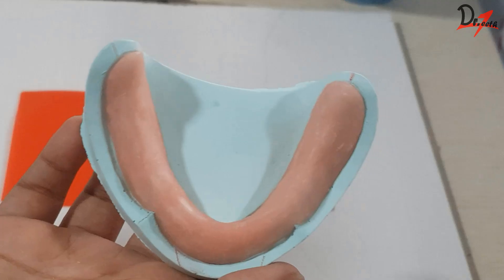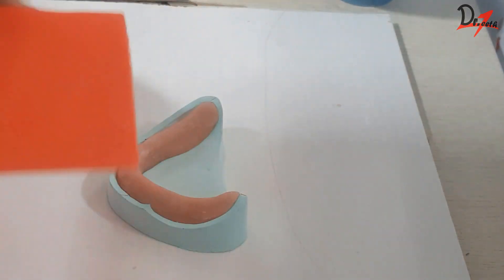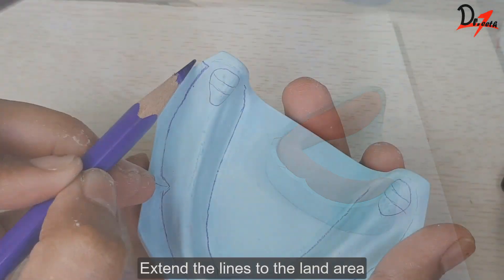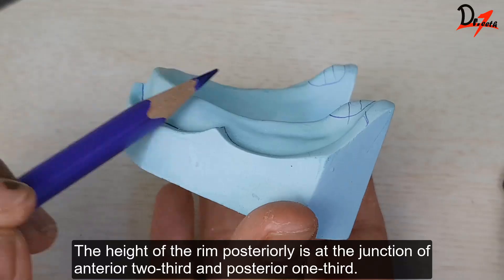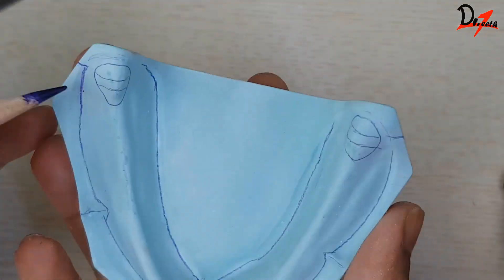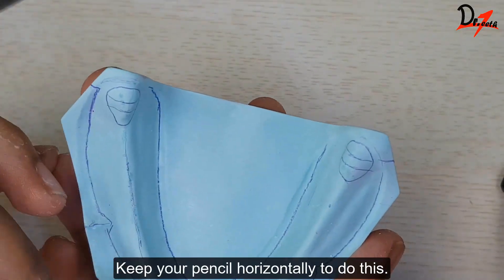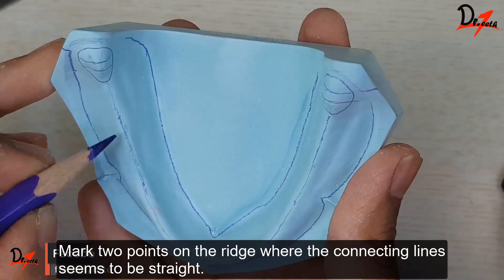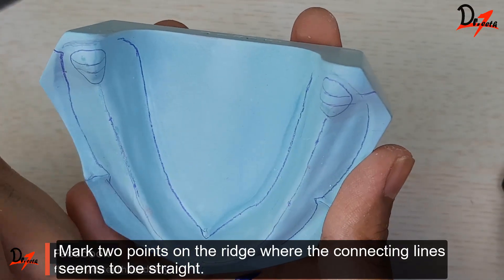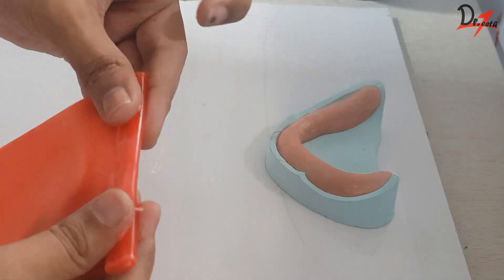Assalamu alaikum everyone. I hope that you all are doing fine. We will start with the mandibular rim by marking the cheat lines. If you haven't seen that video already, I would suggest that you pause this video and go first see what lines or what landmarks we need to draw on the cast, because those lines will help us achieve the proper shape. Once you have done that, we will come back to this video and have a look.